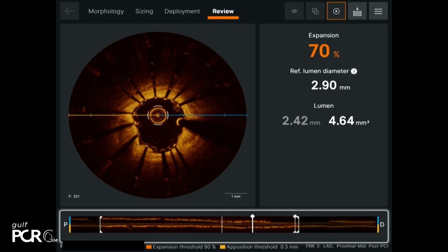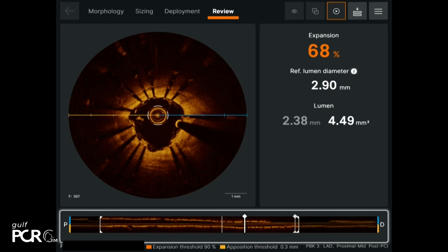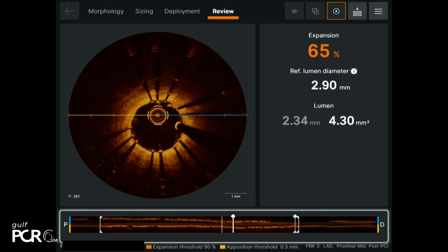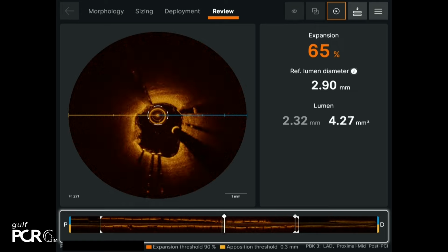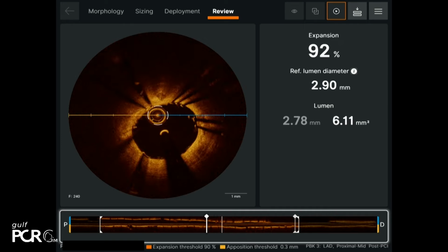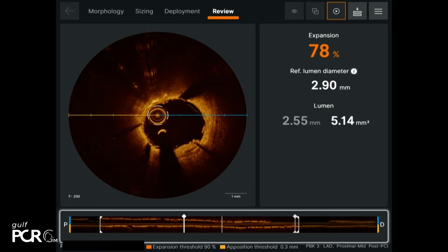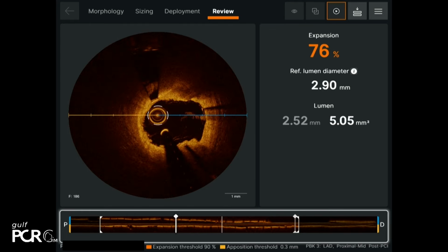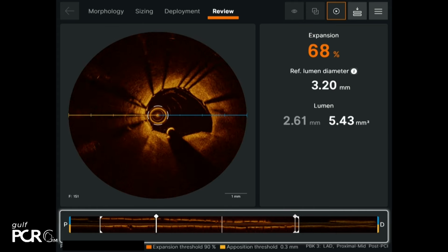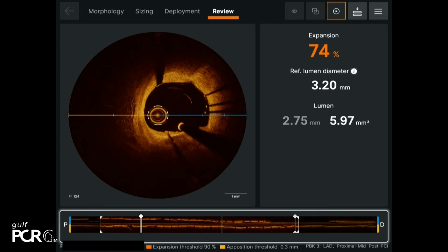You can see in this segment we can go bigger with a bigger balloon. Is that a tissue protrusion or thrombus? Tissue, yeah, clots, yeah. And to be frank with you, the site of the nodule is good so far. And proximally, there's mild malapposition here.